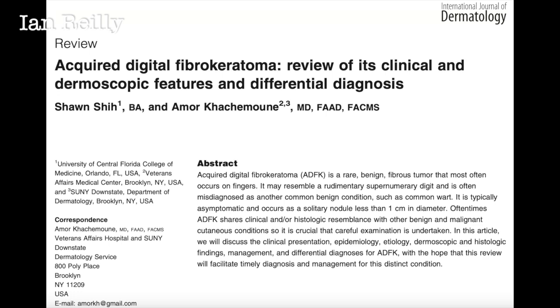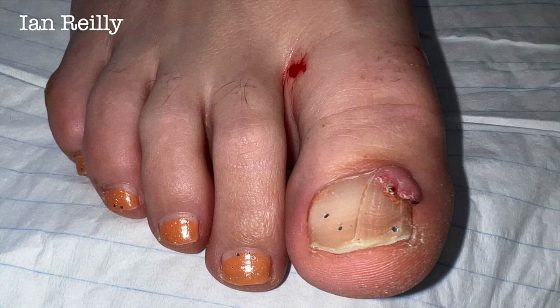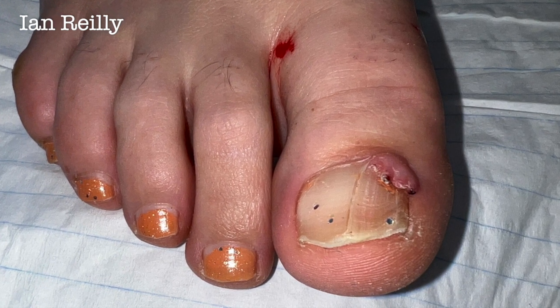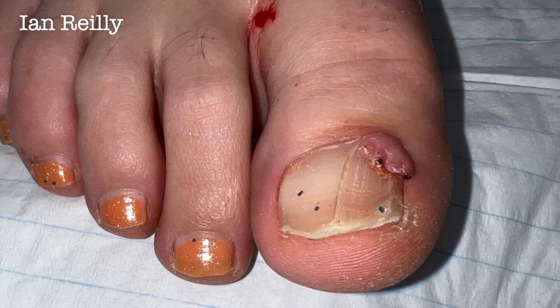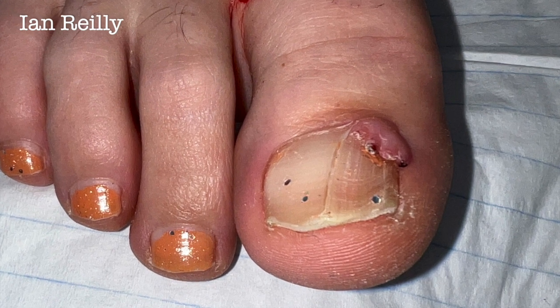I've had two come through in the last month so I managed to video one. This young lady came through with quite a decent lesion that was really causing a lot of dystrophy to the nail plate — it was sore, being a nuisance, catching, and bleeding. It's a benign process, but of course we send them for histology.